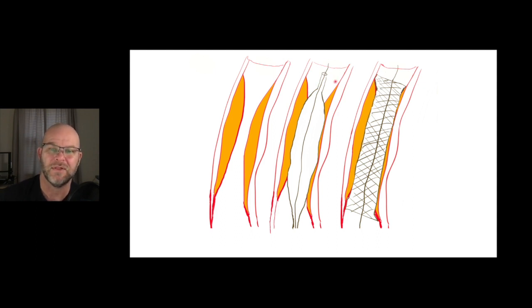Once they have it prepped to the extent that is required, they'll put a stent in. So the stent rides on a balloon, it blows up, the stent locks open, the balloon collapses and comes out. When you talk about stents moving or stents collapsing, that's not exactly what's happening. There are disease processes that will cause a stent to clog back up, but once the stent's there, it's there permanently. And we'll talk in a minute about what the body's going to do with it. But you want those edges to be opposed. That means all the edges are pressed up against the artery wall.